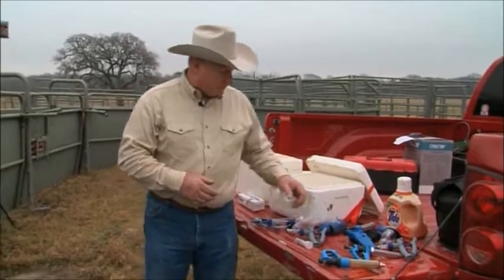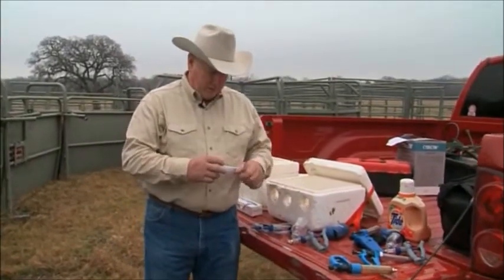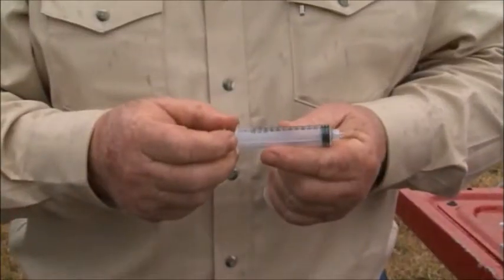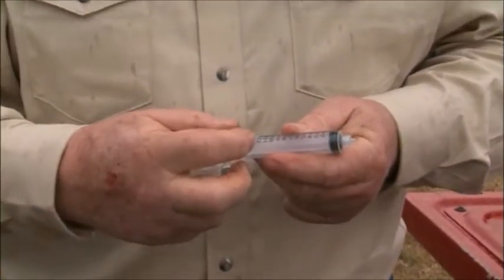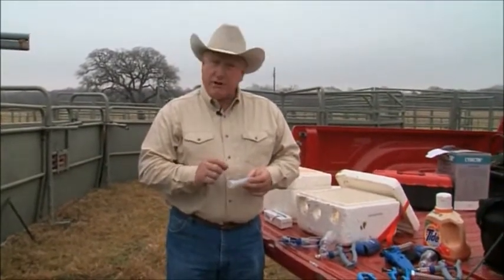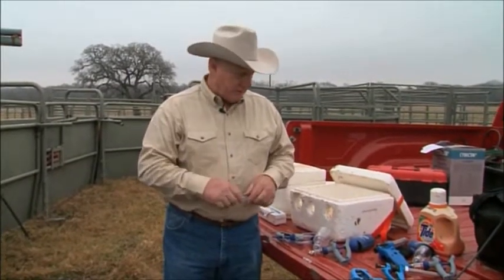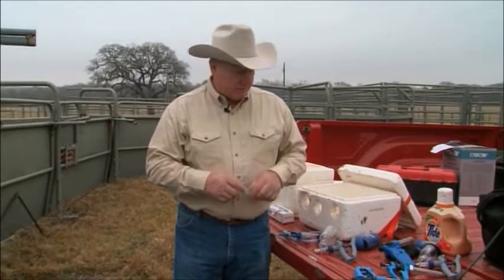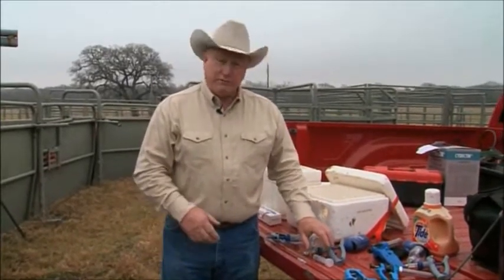There are a lot of different syringes. A lot of people might not use anything but these disposable syringes. They work very effectively, but I encourage everybody to use them as a single dose delivery system and not try to use multiple doses out of one, because if you're off on one animal, you'll be off on another one. So once again, they work good for single dose, which hardly anybody uses them for. That's why we don't normally recommend we use anything more than a 2 or 5 cc syringe for administering products to cattle.